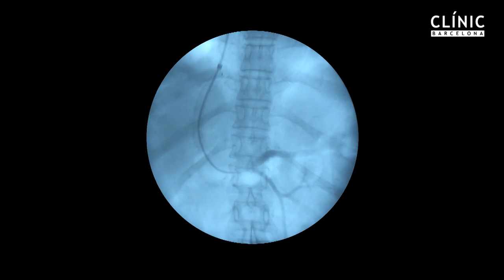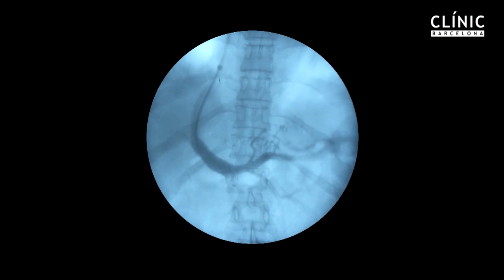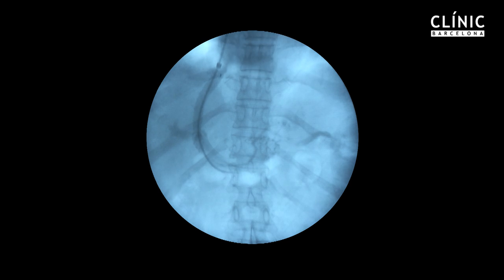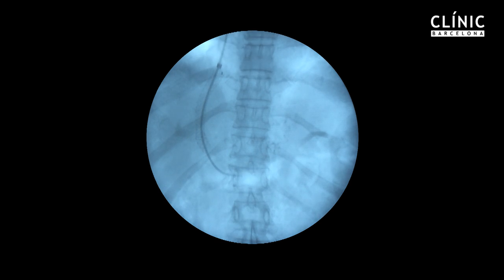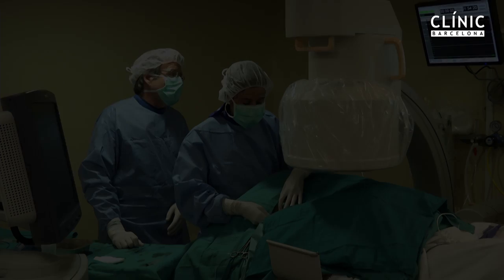Finally, a portography is performed, showing excellent flow through the TIPS.